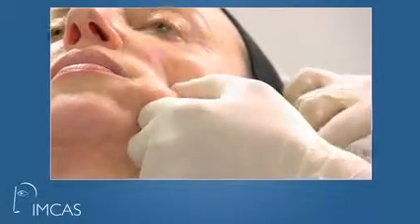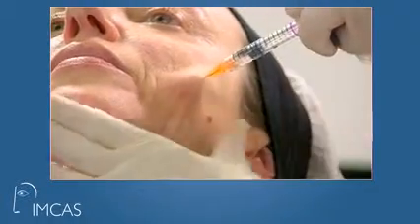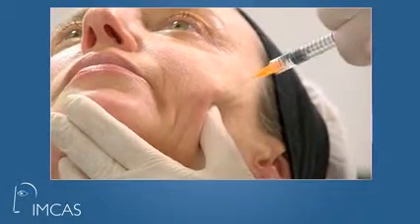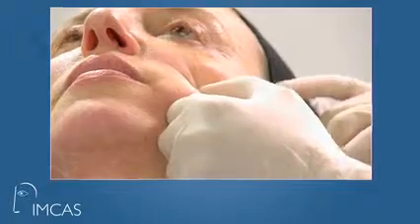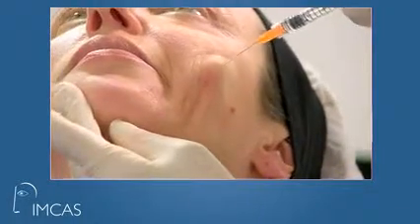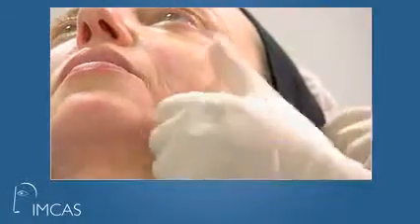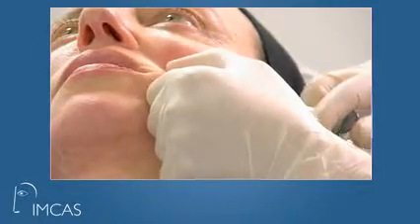I continue in the angle. You see, I move the cannula vertically. I am perpendicular to the fold, of course, as I am injecting the nasolabial fold. You see, I continue the same movement, same gesture. And little by little, we are lifting this fold.